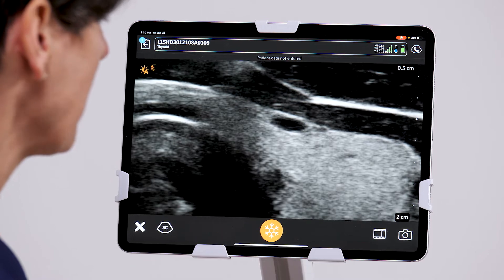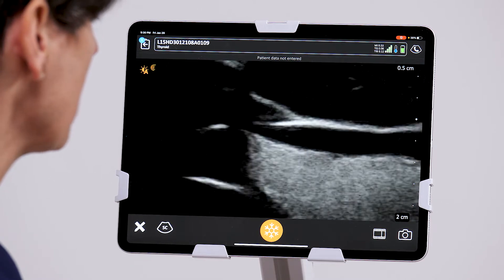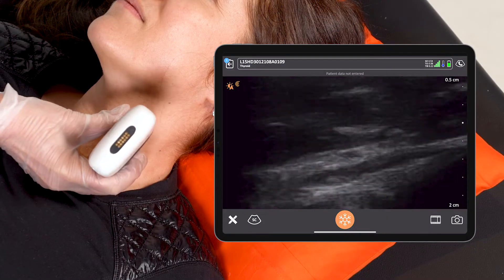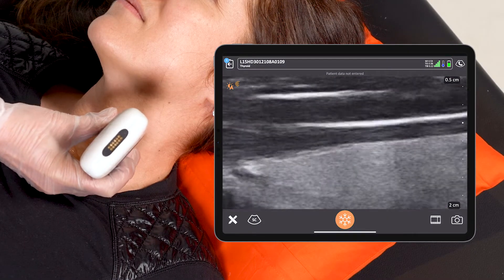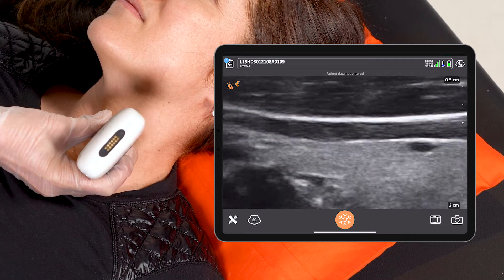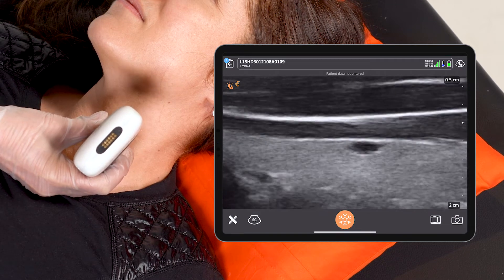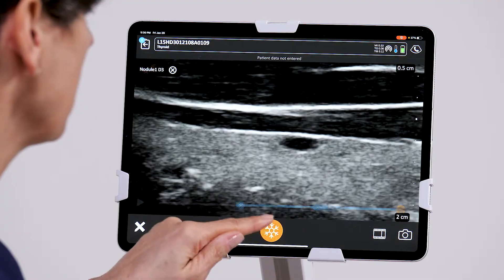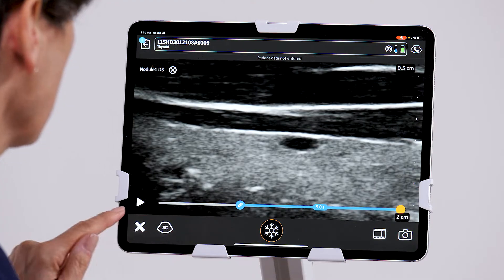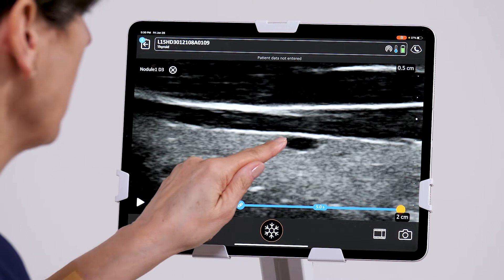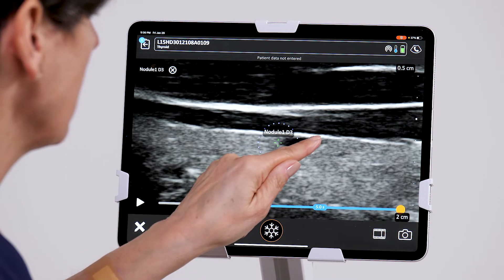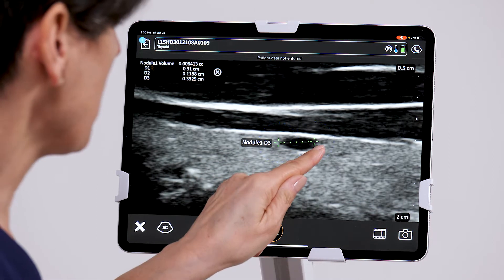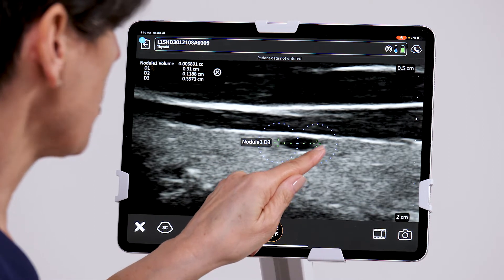I'm going to unfreeze the image, and we'll get the same little nodule in the longitudinal plane, and get a lengthwise measurement of that little nodule.